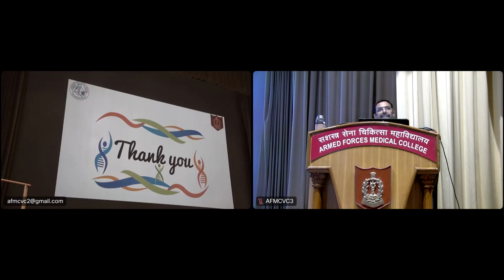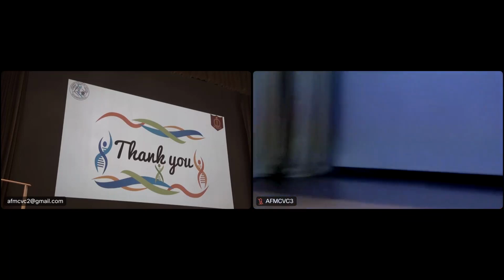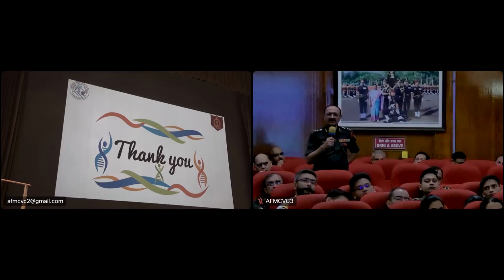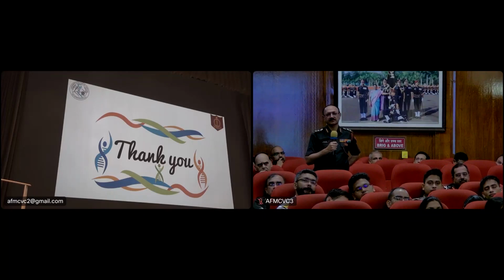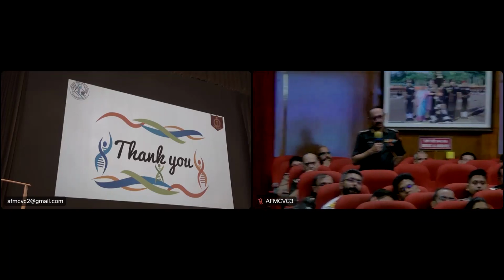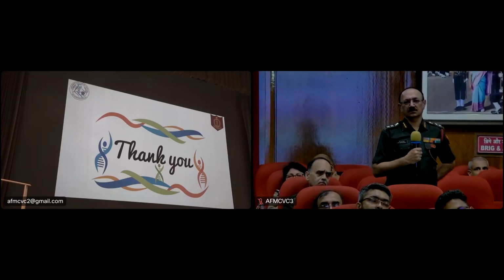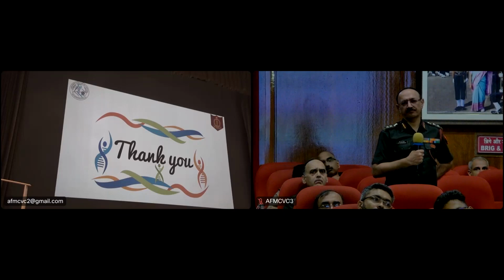As the previous presentation showed about forensic NGS, are we also doing mitochondrial DNA and all? So mitochondrial DNA for maternal lineage, we have a mitochondrial DNA panel with us. It is usually done for rare genetic disorders which are inherited through mitochondrial genomes. We are not offering it on the somatic mode. DNA fingerprinting, the feasibility is there in our lab, but there are a lot of legal aspects that need to be taken care of before we can get into that.